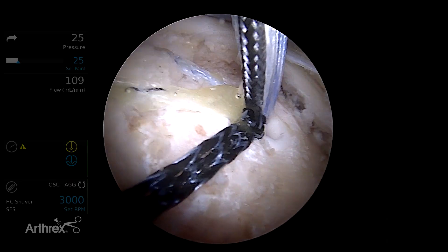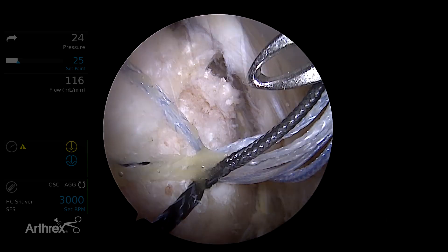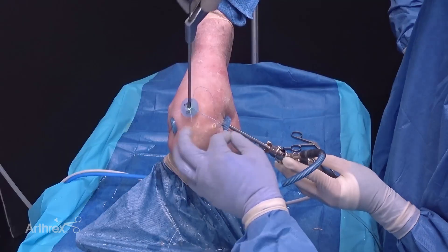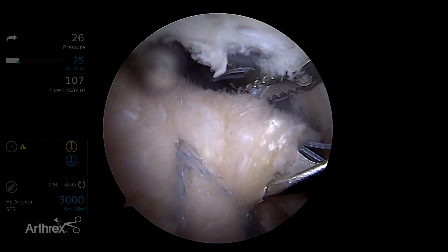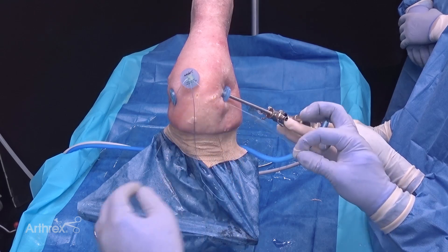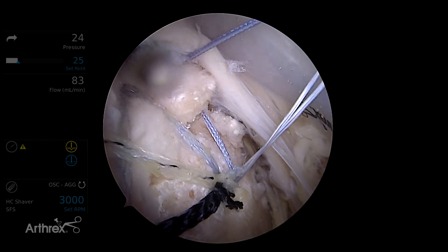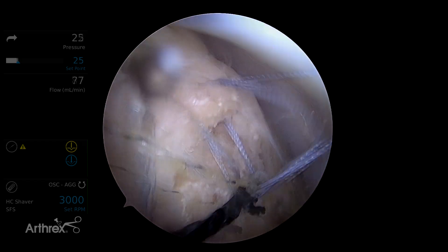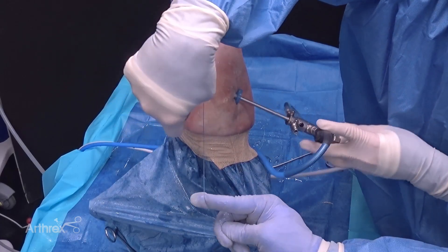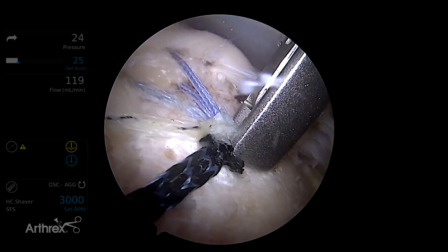Our knotless construct is completed, but we're going to assess the anterior cable. We want to reinforce that anterior cable, which is really important biomechanically. So we're going to cut those fiber tape limbs and with this knotless swivel lock we're going to retrieve the repair stitch and pass this through the anterior cable. Outside the shoulder we're going to load the repair suture into the loop and shuttle the loop through the body of the anchor to engage the knotless mechanism within the swivel lock anchor. You can see this is going to nicely reduce the anterior cable, and while tensioning this I like to use an instrument such as a post cutter to provide a counter force to the bone or anchor as we tension the knotless mechanism.